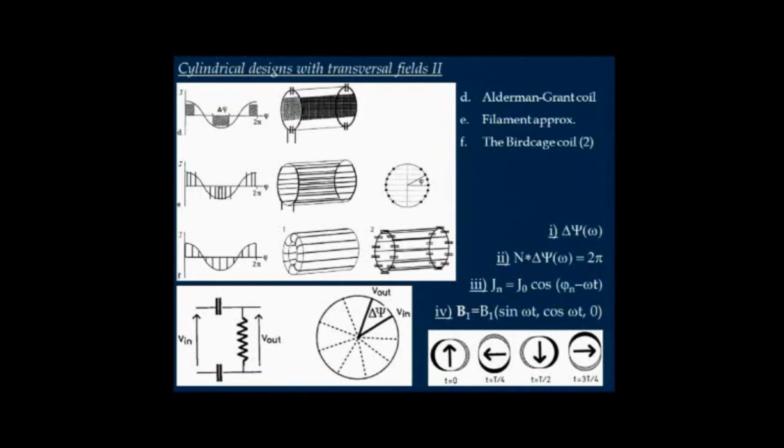If you turn on the time, then you see that this rotates with Larmor frequency again, or with the resonance frequency, and you have a circular polarized coil which modulates perfectly the desired current distribution on as many points as you put in filaments.